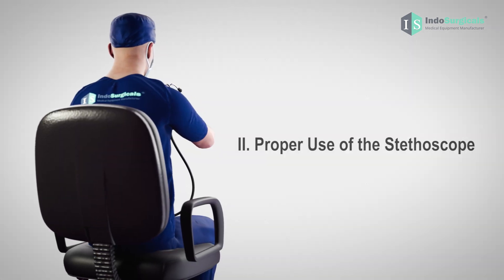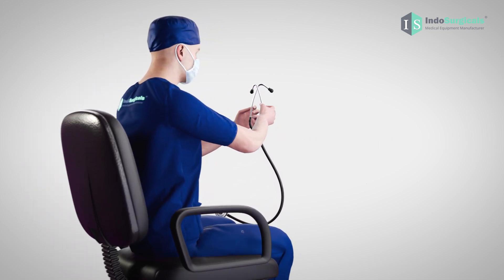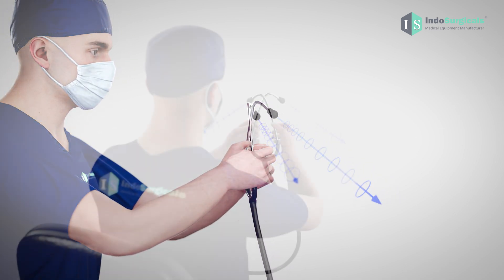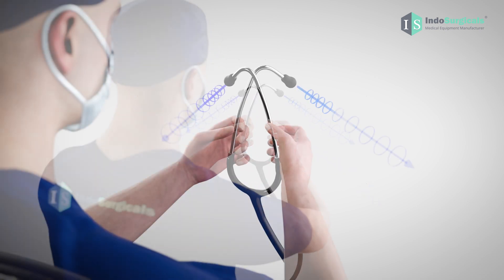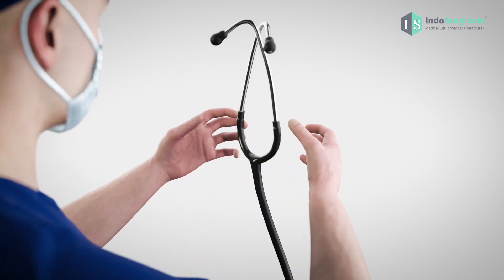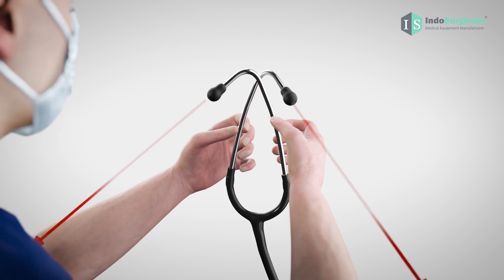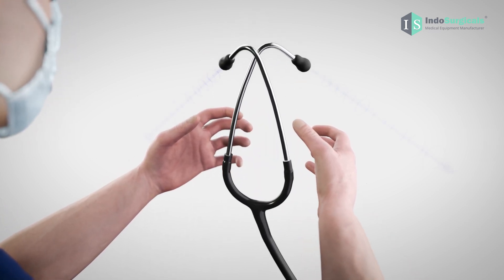Now let's learn the correct way to use the stethoscope. Hold the binaural tube in a way that the ear tip projection faces away from your body, similar to your nose. This ensures proper sound transmission and a comfortable fit in your ears. Holding the binaural tube in the opposite direction with the projection facing towards you will hinder sound transmission and result in an uncomfortable fit.